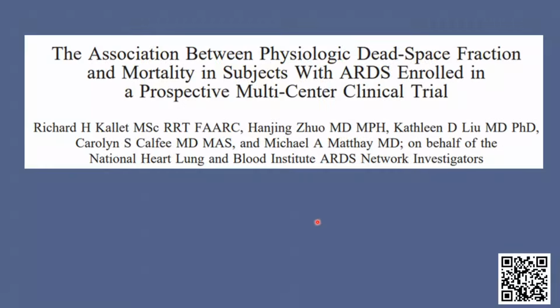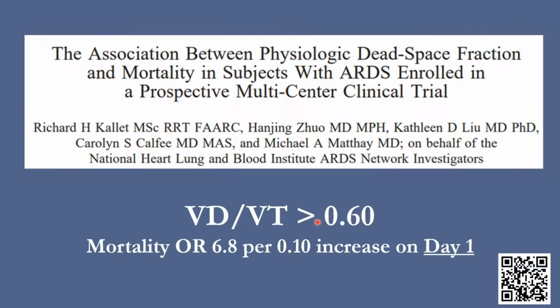Study looking at that question, and particularly just the total physiologic dead space fraction, showed that there is definitely a big uptick in mortality above the 60% dead space fraction. And mortality odds ratio for each increase of 0.1 in dead space increases mortality by 6.8 times using day one values. So this is actually very strongly predictive of mortality.